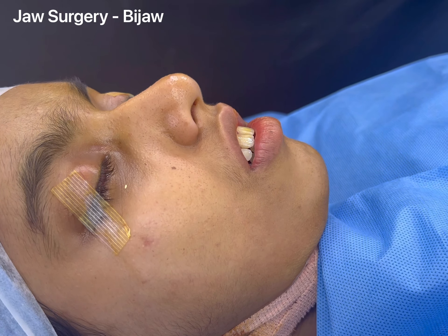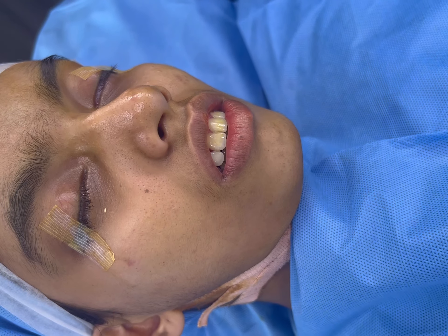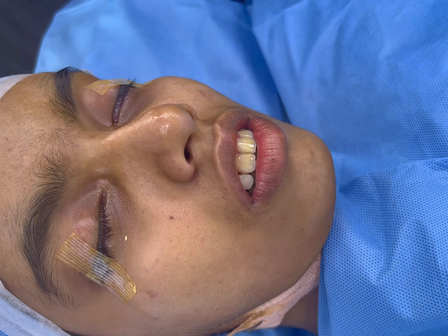We are about to start this face makeover surgery. It's going to be a bimax. The patient's major concerns are incompetent lips and gummy smile.